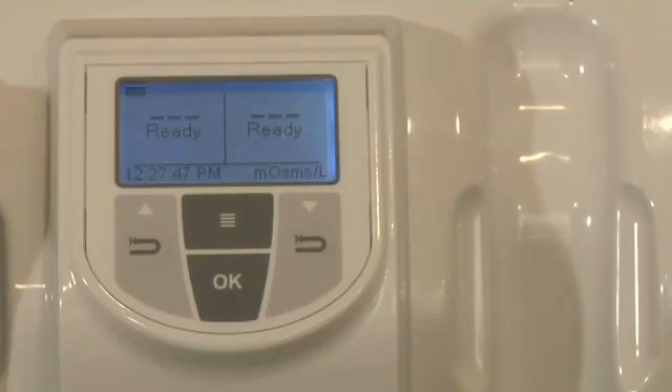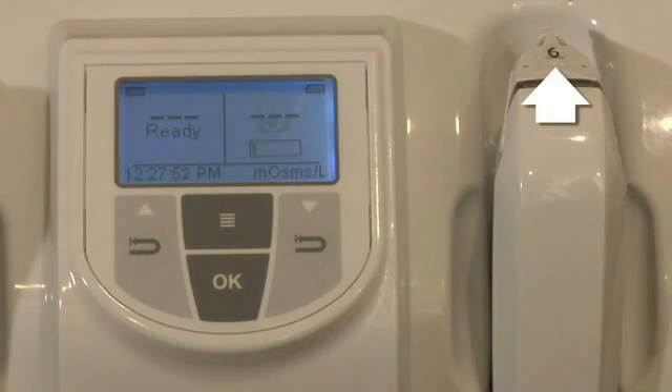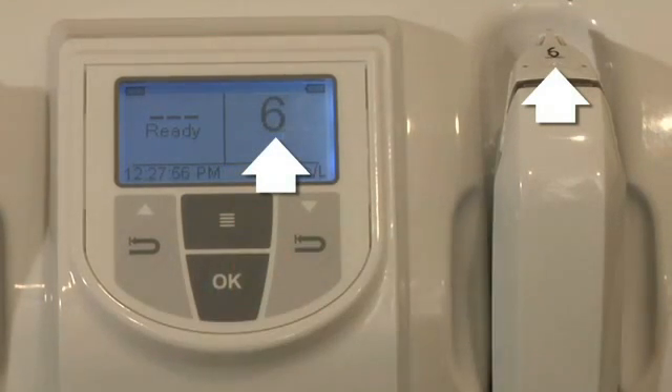Dock the pen into the TearLab within 40 seconds and note the numeric code on top of the test card. Enter the numeric code by pressing the return buttons below the up and down arrow keys on the TearLab. You have 8 seconds to match the codes. Press OK to accept the code.